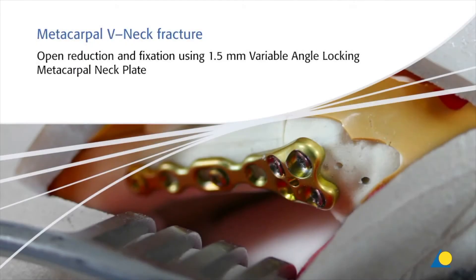In this exercise, a fifth metacarpal neck fracture will be fixed with a 1.5 variable angle locking metacarpal neck plate, which is designed with an anatomic contour and hole configuration to facilitate fixation of the head and neck of the metacarpals.